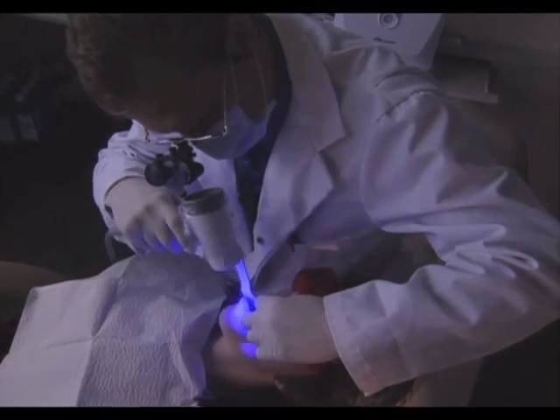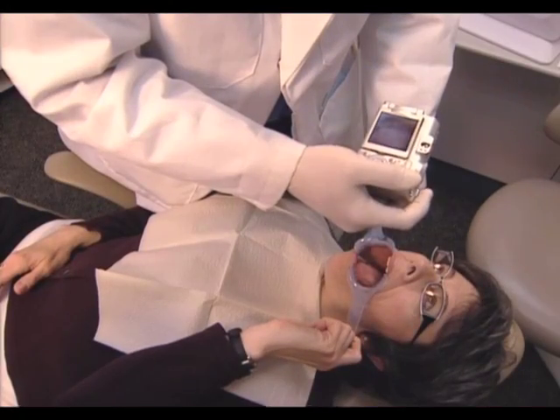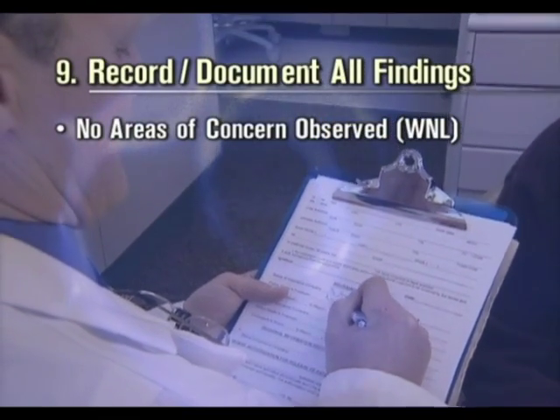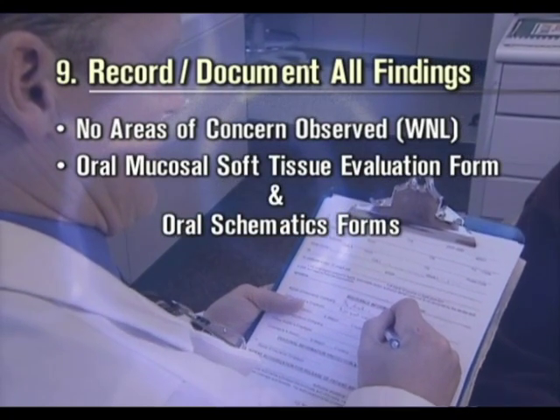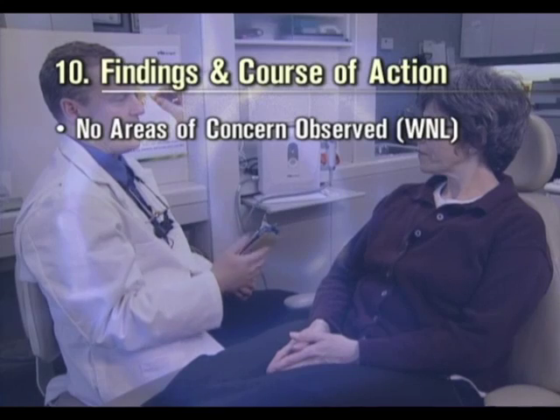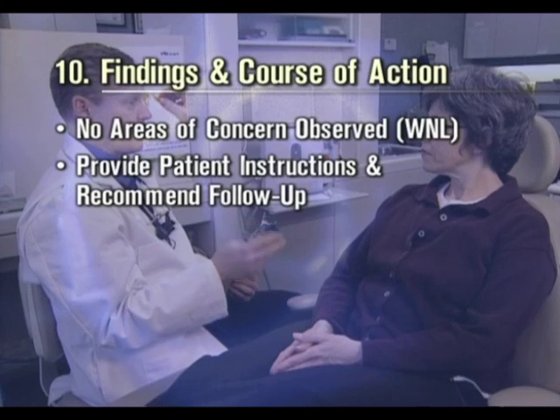Repeat the visual examination of intraoral structures with fluorescence visualization using the Velscope. Photo-document any areas of concern, both with visible light and with Velscope. Record and document all findings, recording no areas of concern observed within the normal limit if appropriate. If an area is discovered, the oral mucosal soft tissue evaluation form and oral schematics forms can be used or referred to for assistance. Inform the patient of all findings and recommend course of action, stating that there are no areas of concern observed within the normal limit if appropriate, or if an area of concern is noted, provide patient instructions and recommend follow-up.